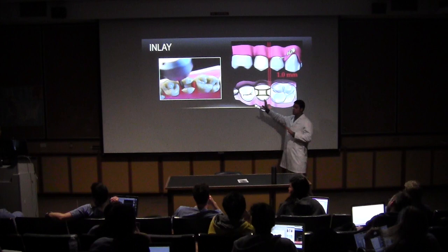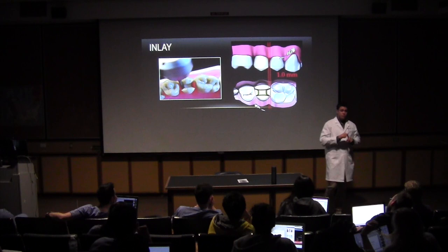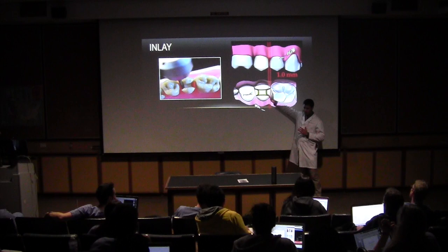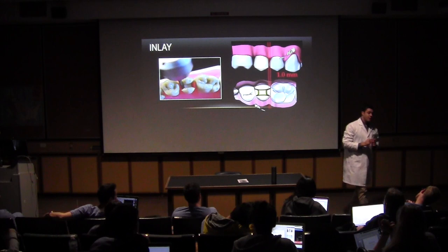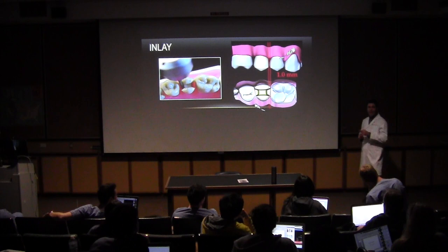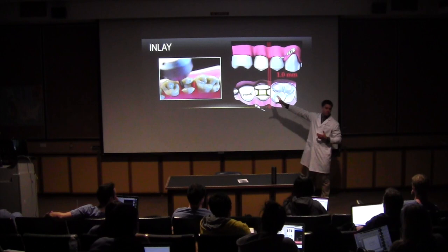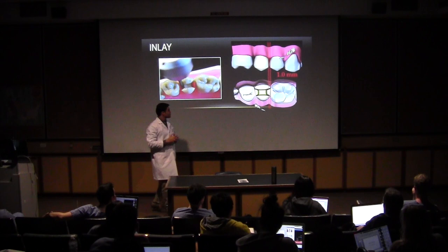No, we are thinking here on indirect preparation, because of two main things. The first one, the lab technician needs room to do the die test and use a saw here between the adjacent tooth and the tooth that you are doing the preparation. And the other thing is that you want your prep to be scanned by the CAD CAM. So you must have this clearance here so you can see the margins on the proximal boxes. All right? This is clear? Okay.